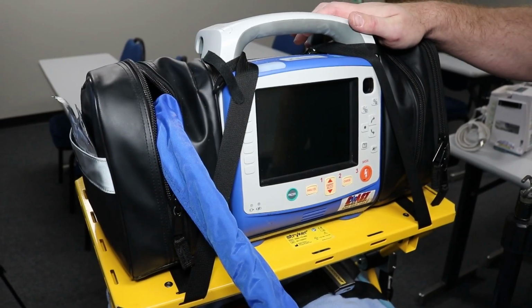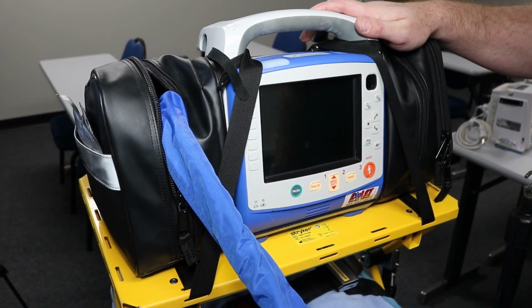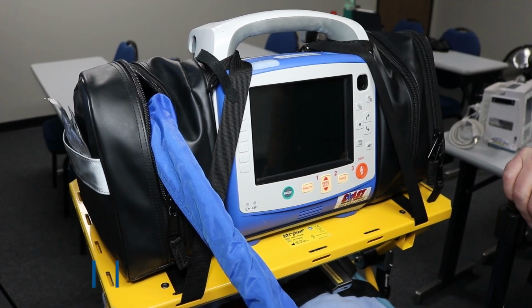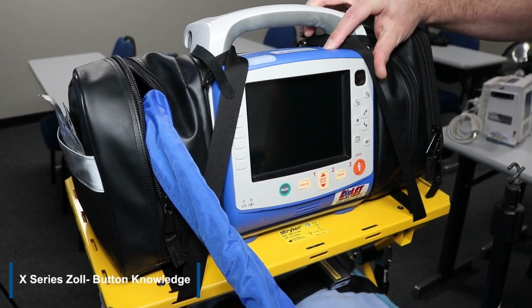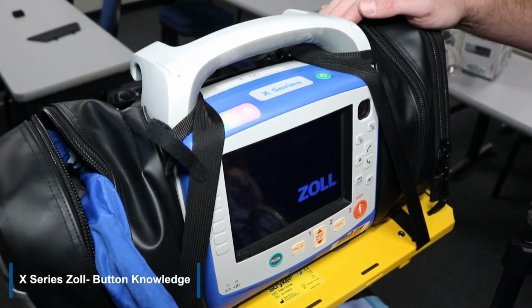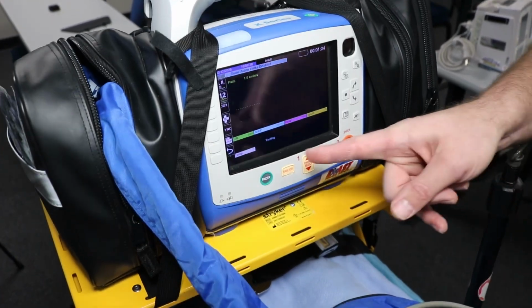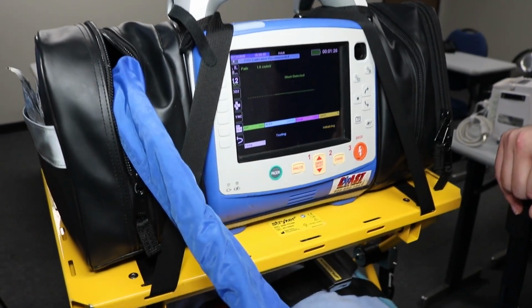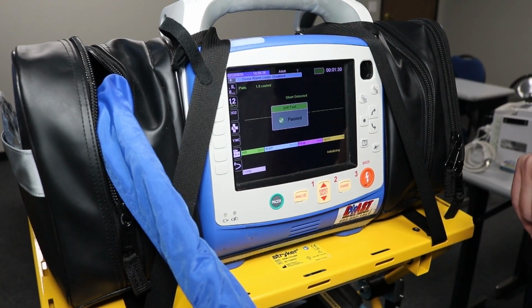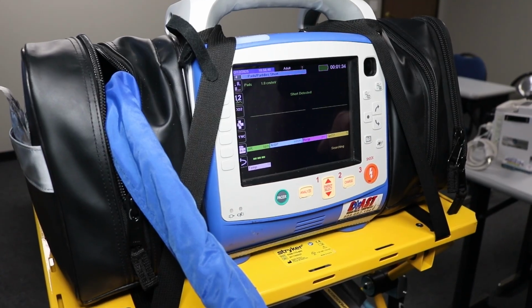How to program our X series Zoll, turn it on, program our Q15 minute vitals, and any other buttonology we need to go over. So to turn on, we're just going to press and hold this green button until you see these lights light up. It takes a few seconds and it'll go through a self-check, do any tests. Self-test pass. At that point, we can start programming it.